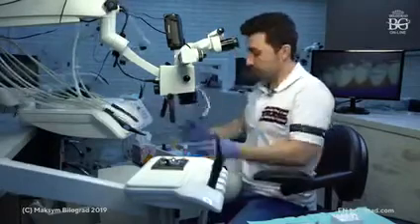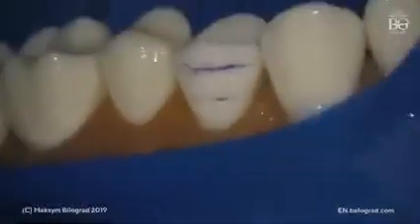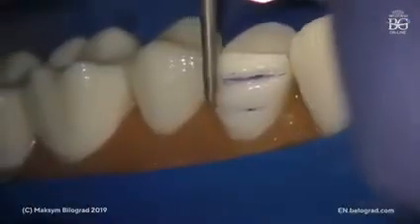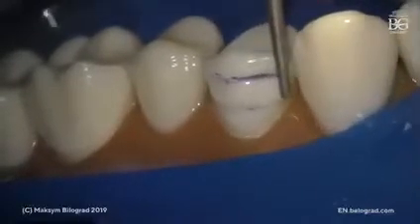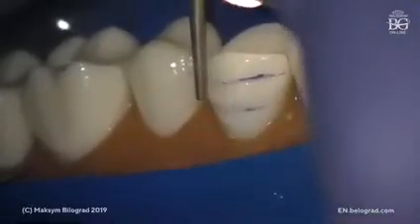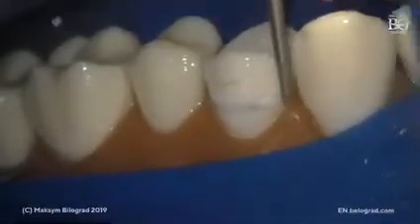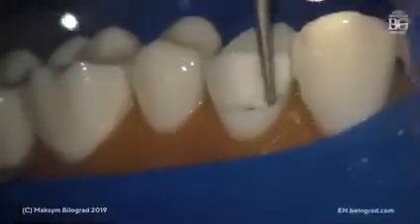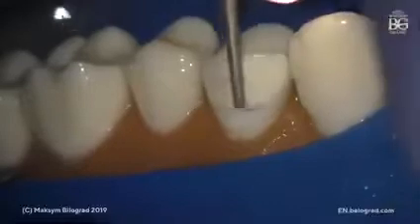Okay, and the same burr as I used for previous teeth, this tapered number 16, incisal plane. In this case, when you have prepped the full occlusal surface, the pathway of insertion for the restoration will be more vertical, like a crown. So in this case we have to prep the buccal surface more like a crown. So basically there will be two plane preparations.